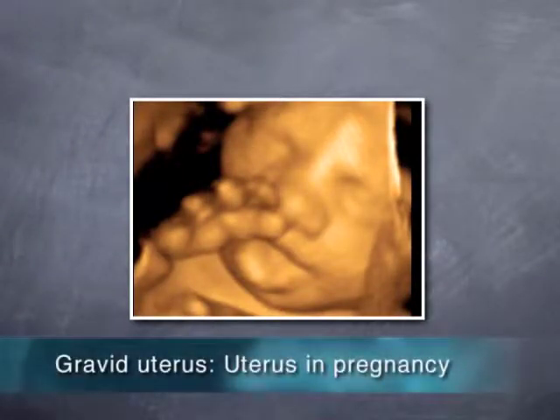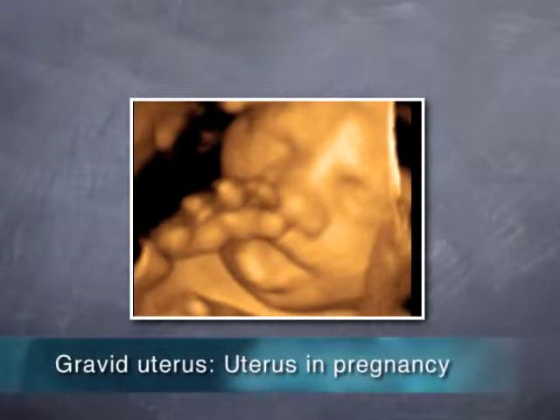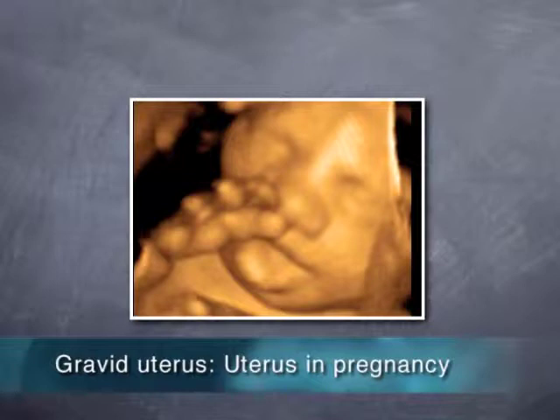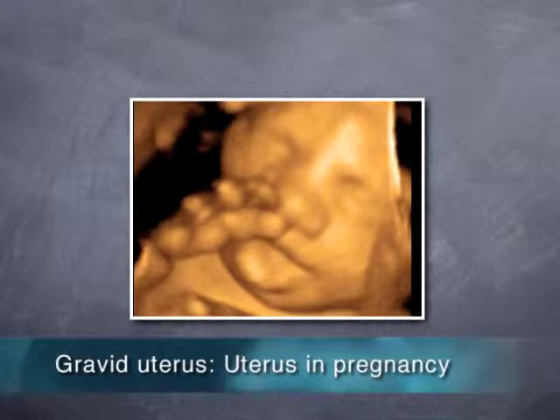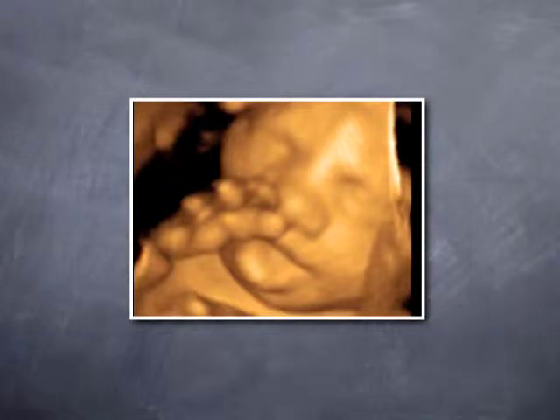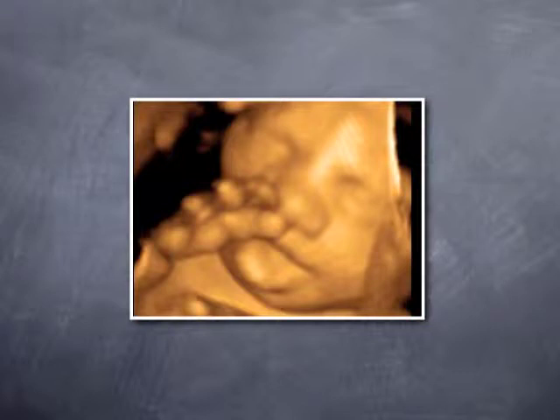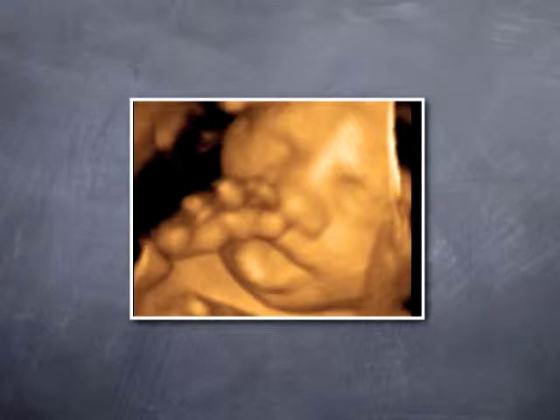This is a three-dimensional image of a gravid uterus in which we're looking at a fetus. The fetus is somewhat tilted — there's the nose, the tongue, the chin, the eyes, the forehead, and the hand coming up. As a lot of parents like to think, it's getting ready to put its thumb in its mouth.